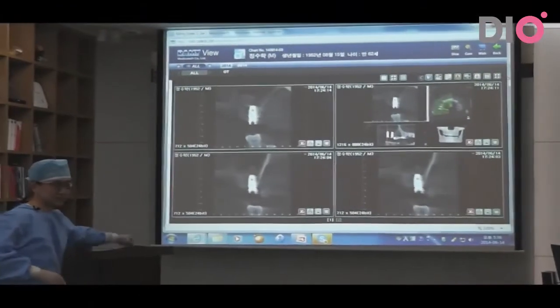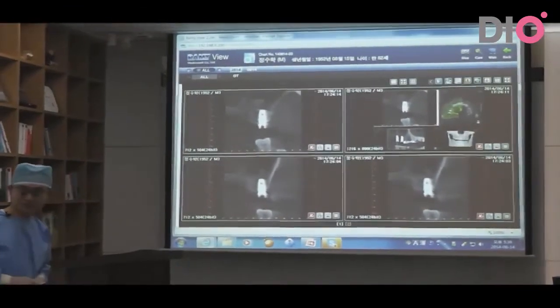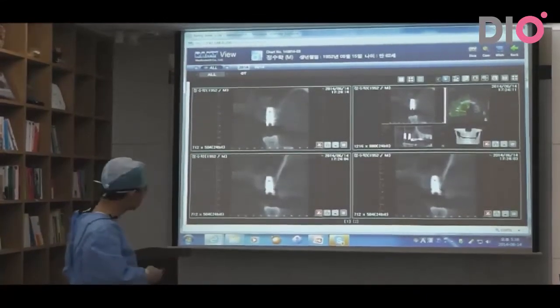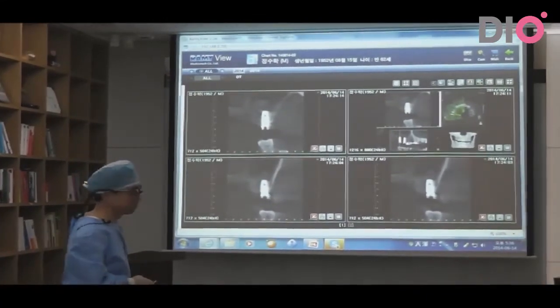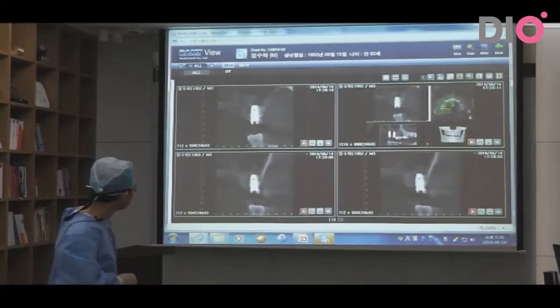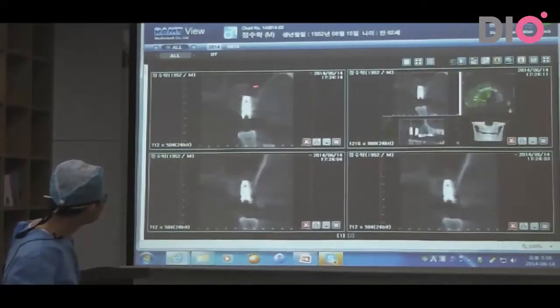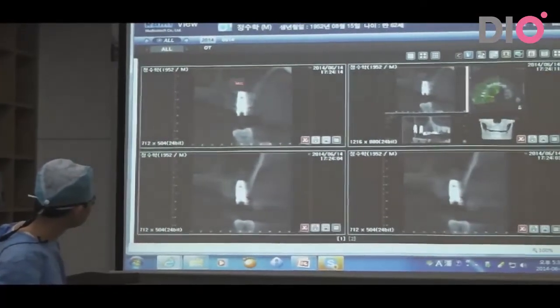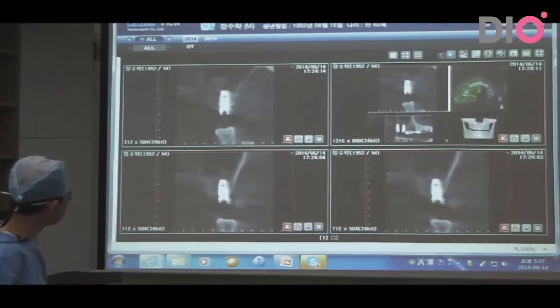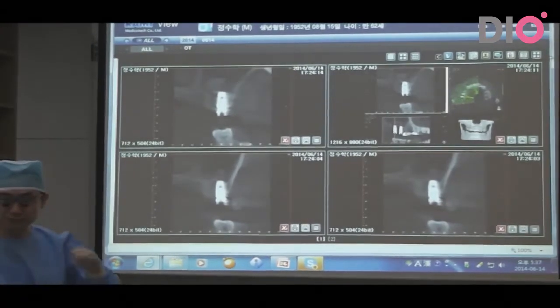Okay, the final radiograph has arrived. You can see the x-ray, the CT view of the patient after the procedure. You can see here the implants and the graft material. This one and this one. You can see here the collagen sponge placed above the implants.